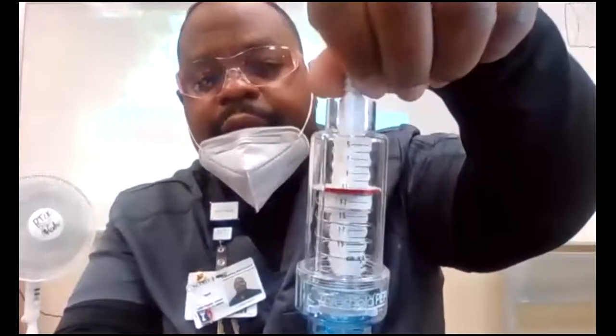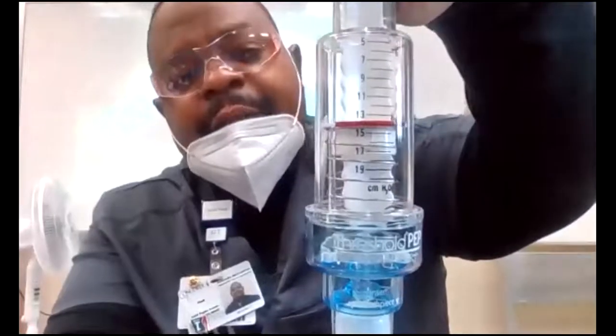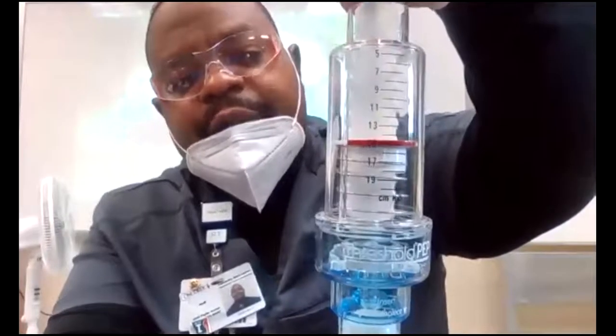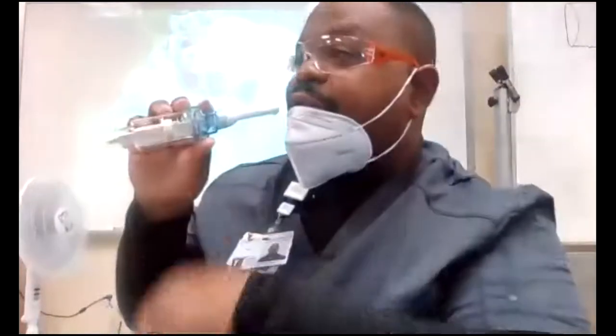See that? So I'm on 15. The doctor said, I want 15 centimeters of water of positive pressure. And I turn it to 15, right? And then the patient will blow against it. When they blow in it, it doesn't flutter, but it gives back pressure in the lungs, okay?